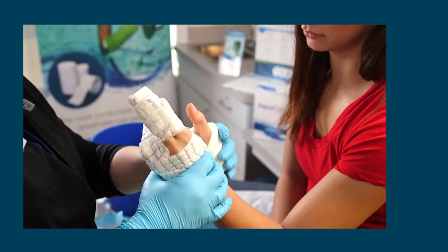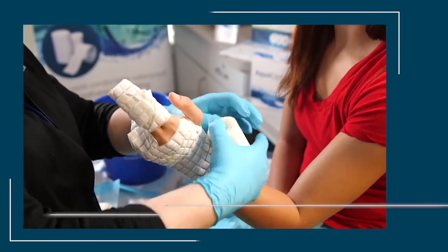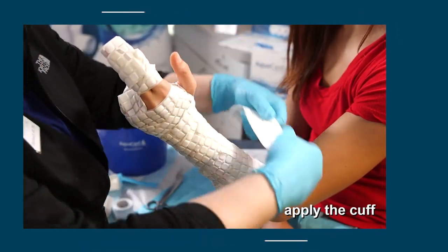Proceed with a short arm cast application. Use 50-50 coverage. Apply the cuff.